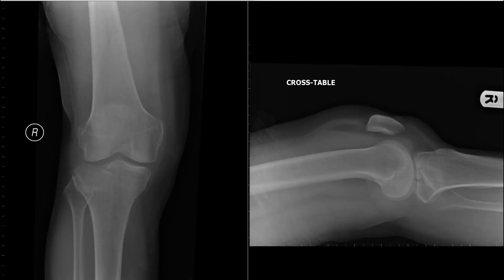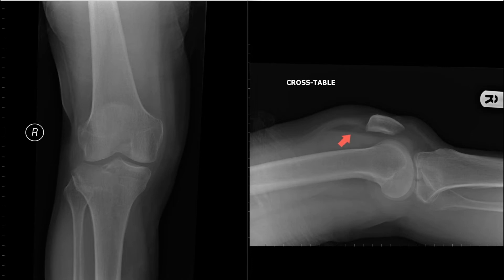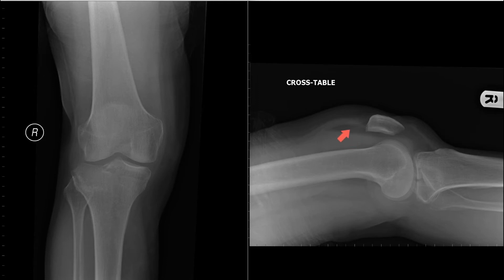Here is a patient who has a lateral tibial plateau fracture. This is fairly obvious on the AP view, which is a vertical beam. But if it was more subtle, you might look to the lateral view looking for a lipohemarthrosis. This is a cross-table or horizontal projection, which means that any fat fluid levels are going to be seen. If the lateral view is a vertical beam, you're not going to see a lipohemarthrosis. So it's very important that it is a cross-table or horizontal beam.